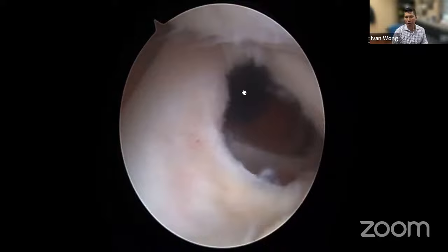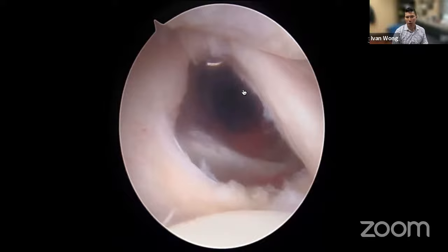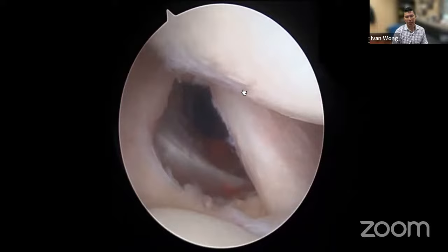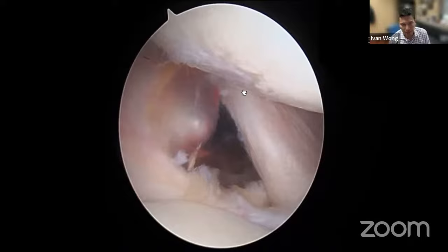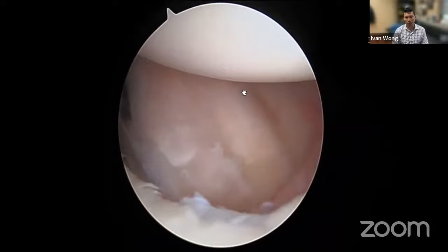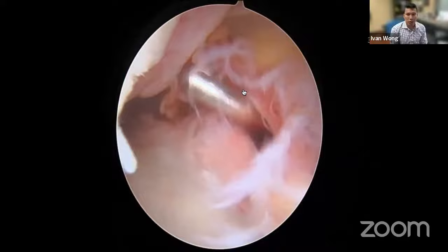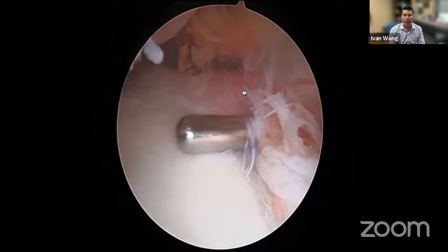This entire view is shown at one-to-one speed so we can describe what's going on. Here the needle comes down to identify our anterior superior portal — the angle of approach is significantly different. We open the skin and put a switching stick in the same spot, going through our rotator interval opening. The switching stick heads down toward where the Bankart tear was. I then put the scope into that anterior superior portal.